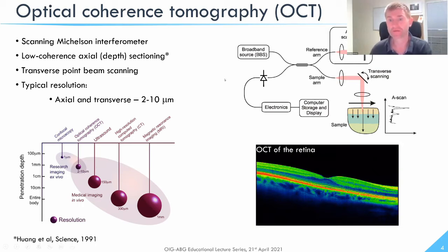So this slide here illustrates the original version of OCT, which was called time domain OCT, where we scan the reference mirror, and then you have the path lengths matched to within the coherence length of the light source, allowing you to effectively optically section through the tissue. This variant allows you to scan A-scan rates, or depth scans, over a couple of millimeters, up to several kilohertz.